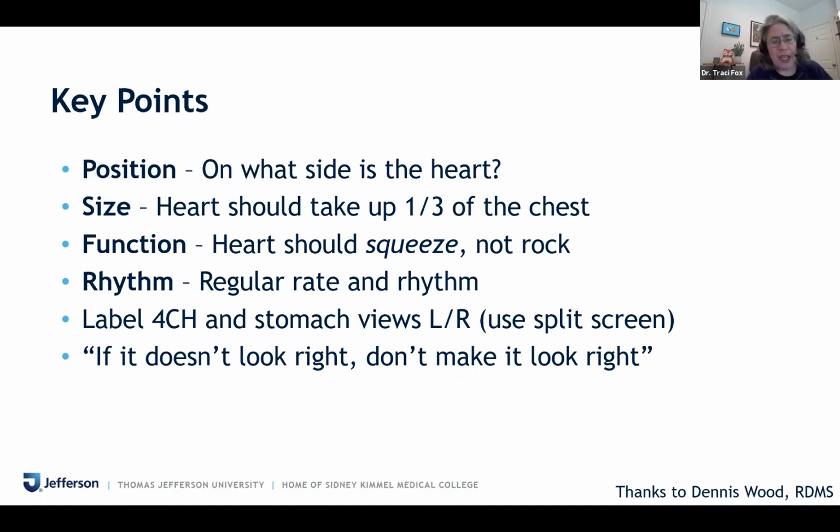You can't get a 4-chamber heart, and you keep scanning and you can't get a 4-chamber heart. So you take something that sort of looks like a 4-chamber heart and you label it 4-chamber heart, and the baby is born with a cardiac defect. Now, that's never happened to me that I'm aware of. Why? Because I don't try to make it look right.